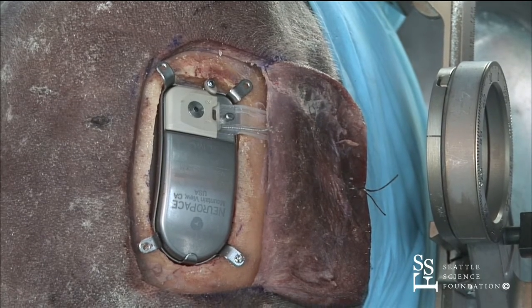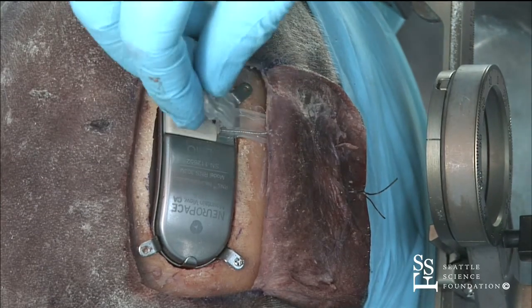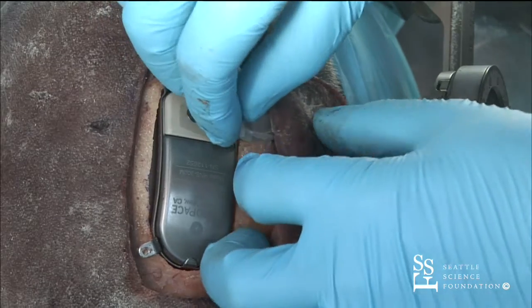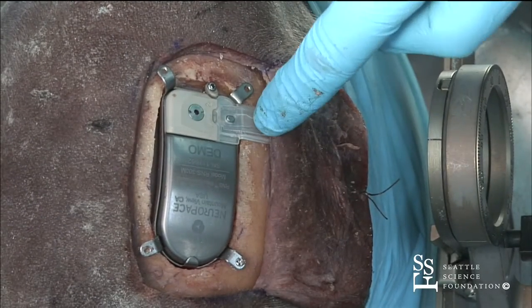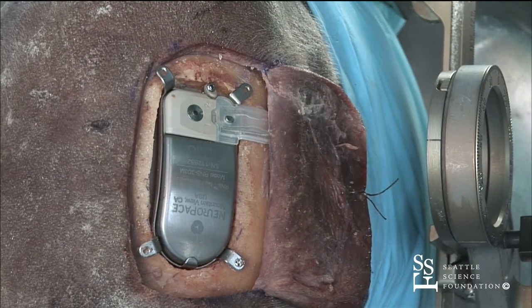Oh yeah, here it is. So this little strain relief cap, if you do happen to put it in an orientation where it's crossing the incision, and sometimes that's what works out to be the best, then that strain relief cap will really protect you if you're coming back later and have to cut over it.